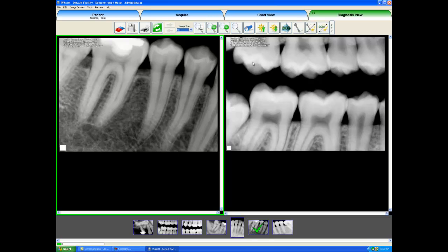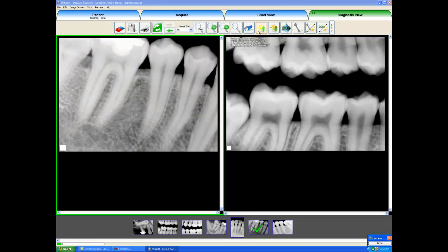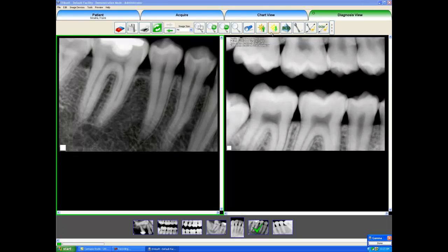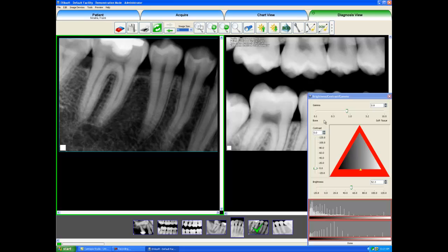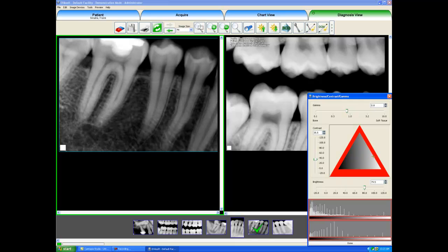Now we can always brighten or darken an image, should it be under or overexposed, by clicking these two buttons. When the sun goes up it gets brighter, and when the sun goes down it gets darker. We can also manually do it by clicking the Brightness Contrast Gamma button, then I select the yellow triangle in my window, and as I move it around the image changes in contrast. The grayscale triangle is the optimal area, so you always want to leave the yellow triangle within that grayscale triangle. If you go off the chart, your image will get burned out or washed out — it will become too dark or too light to really view anything diagnostically.